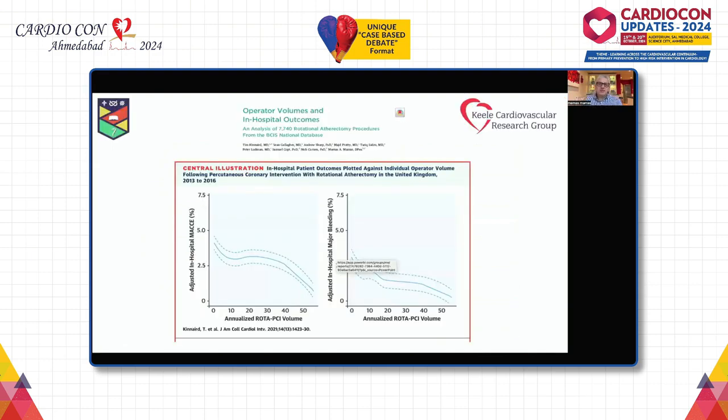One of the reasons that's driving this is that, unless you're doing a lot of rotational atherectomy cases, your outcomes tend to be compromised.